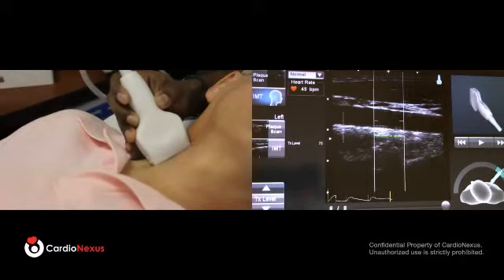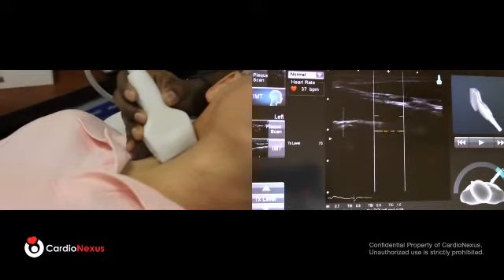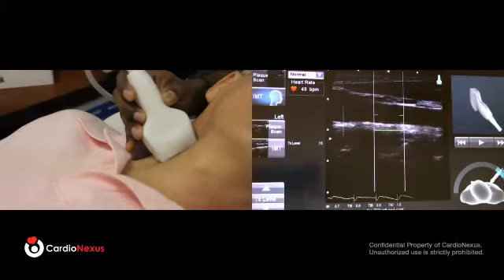Again, we'll run through our two checks, the first of which is referencing the angle guide on the bottom right of the screen. In this case, it is the correct angle. The second check, however, is seeing if the dotted line on the left side of the screen falls into the widest part of the artery or at the flow divider. That fails. So I will unfreeze the image, pull up towards the patient's head, and then now that I have identified the widest part on the right, I'll hold the probe still, and as you can see, it captured one more image.